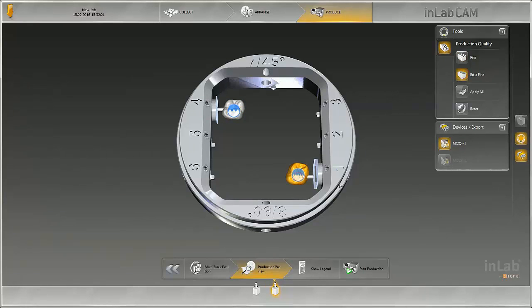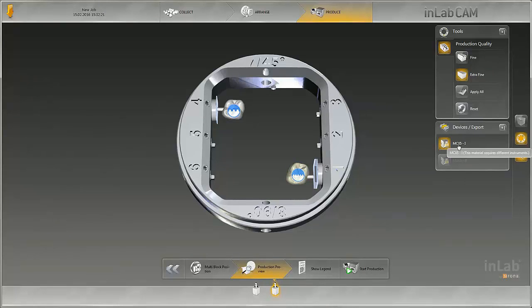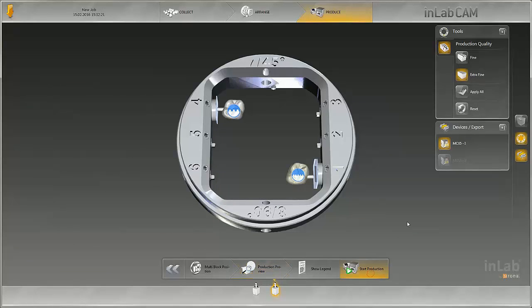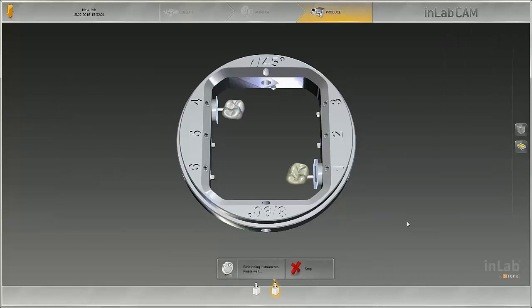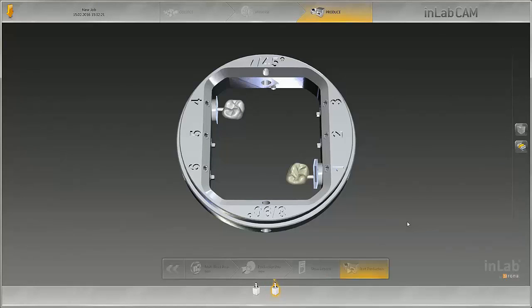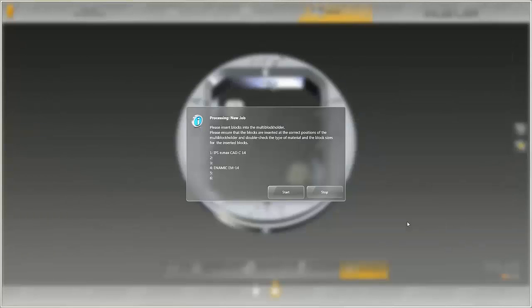If the selected machine is not equipped with the right tools, this is shown in an information window when you scroll over the machine with the mouse. In such cases, when production starts, you are taken automatically to the instrument change function. After selecting the right instruments, you can start production.